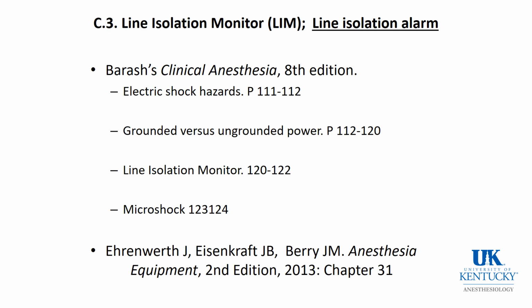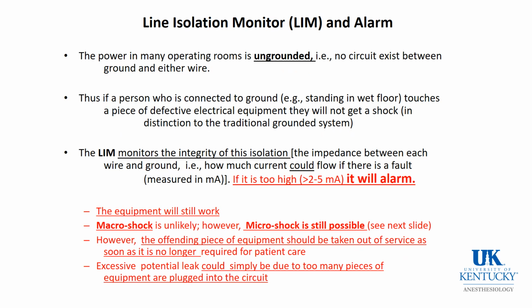And talk about another keyword, which is line isolation monitor, and I've provided you here some references which I found very helpful. It says there's a leak in the system, and there is still risk of microshock, but no risk of macroshock. All of the equipment will work.